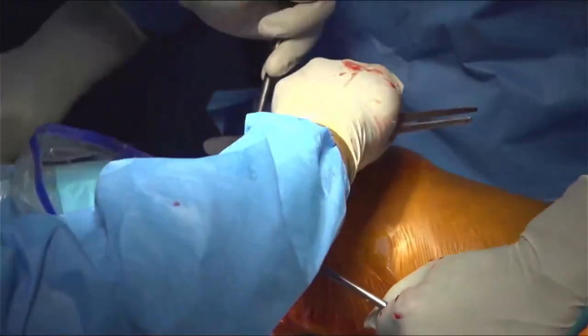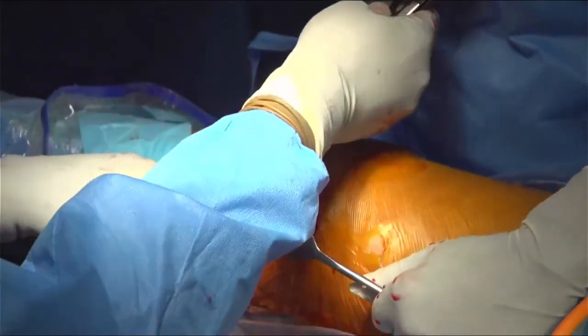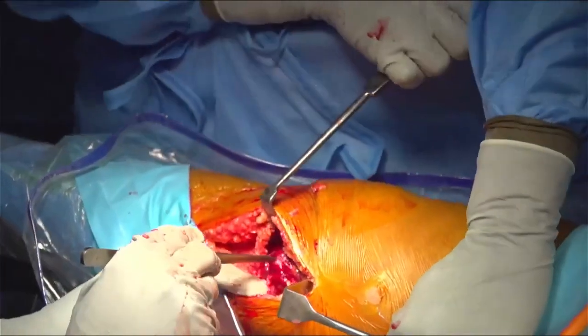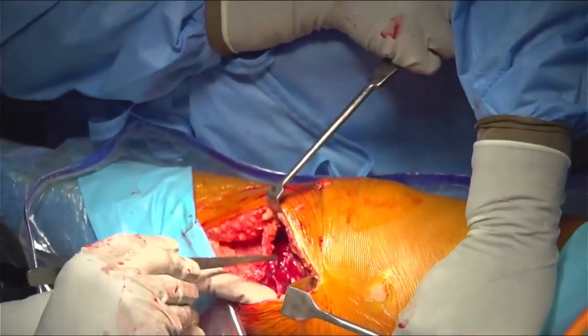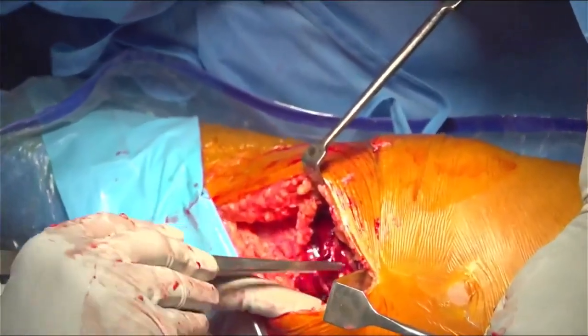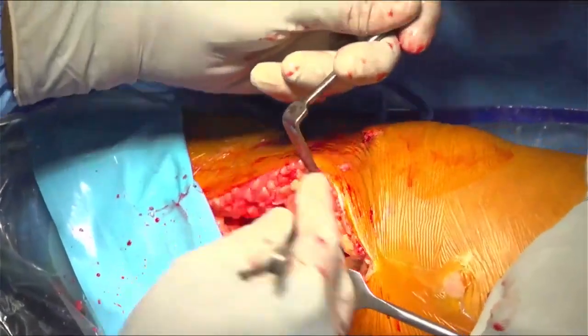Give me the valgus. So if you can see, this is my meniscus. Okay, and this is the meniscotibial ligament. So this is the meniscus and this is the meniscotibial ligament here. Okay, and we need to repair it here. Okay, relax a bit.